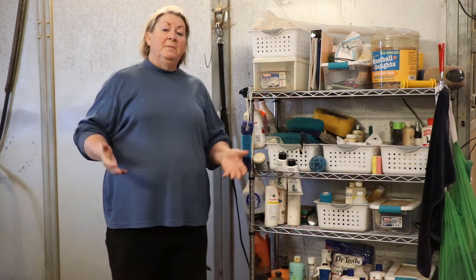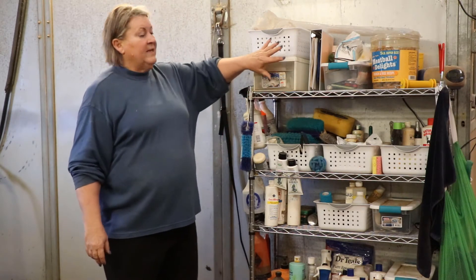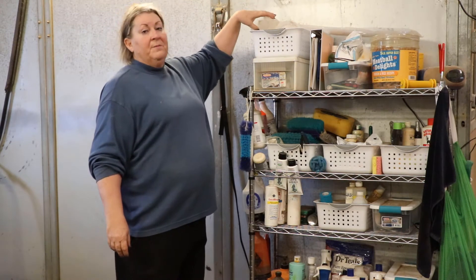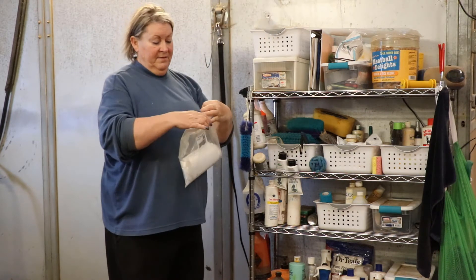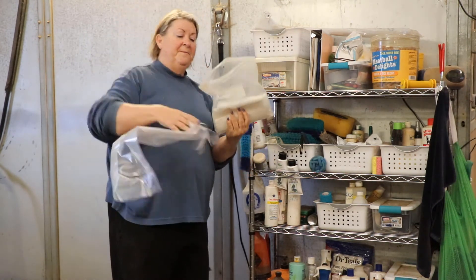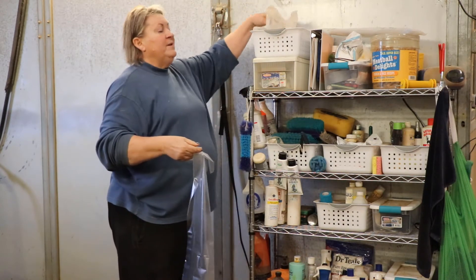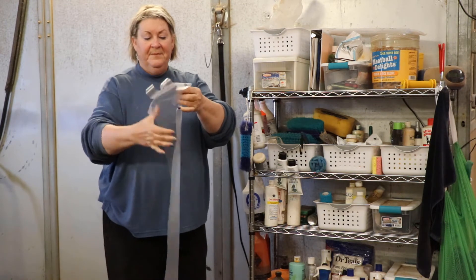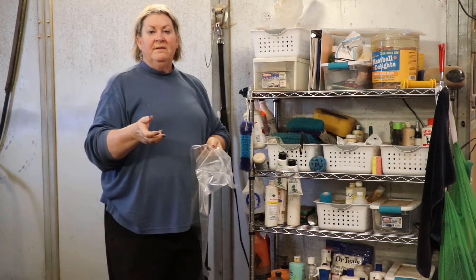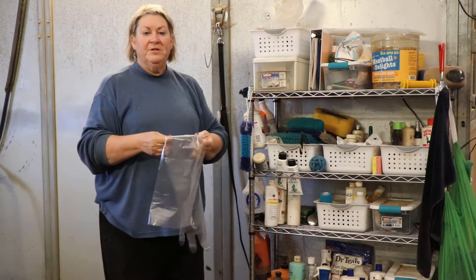We're back again here. You've seen the palpation chute where we put the mares in for the vet to check. Now let's talk a little bit about the supplies that you need to have on hand when the vet's getting ready to do their work. It's good to keep them all close and handy right here so the vet can just step around, grab what they need, and go right back. Paper towels — always a necessity. One of the real important things is when the vet needs to palpate or inseminate the mare, you have these shoulder-length sleeves. You'll see it's just a shoulder-length sleeve — put your arm in and be able to very cleanly work on checking the mare.